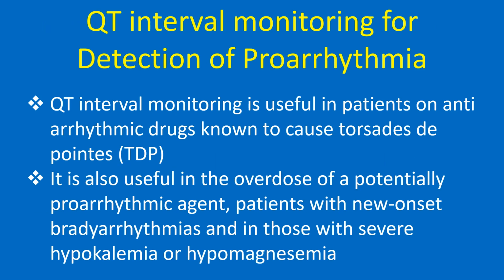QT interval monitoring is useful in patients on antiarrhythmic drugs known to cause torsades de pointes. It is also useful in the overdose of a potentially proarrhythmic agent, patients with new onset bradyarrhythmias, and in those with severe hypokalemia or hypomagnesemia.